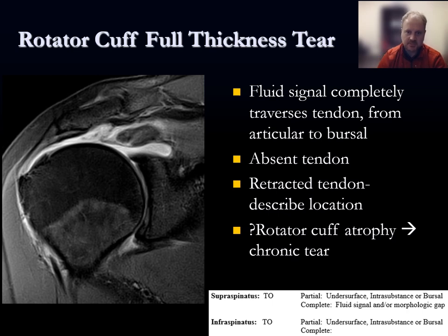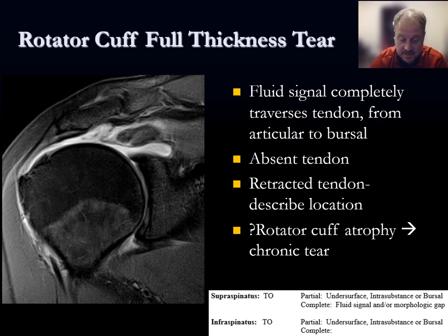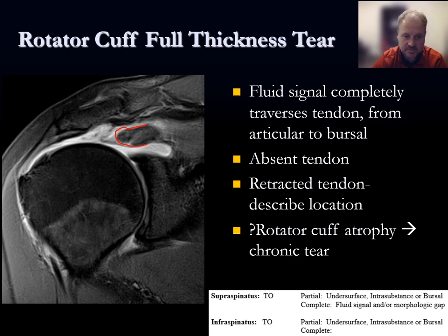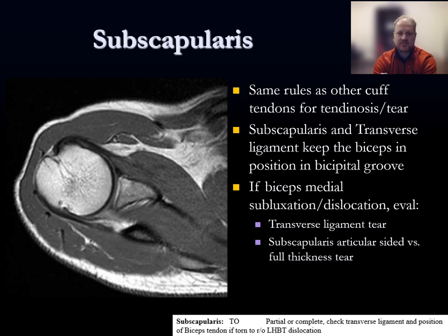A full thickness tear is where fluid signal completely traverses the tendon from articular to bursal side. Additional descriptors include whether the tendon is absent or retracted, and if retracted, where exactly the tendon stump is located. On chronic tears, note any muscle atrophy. On coronal images — especially when there's substantial joint fluid or bursal fluid — you can find and localize the retracted tendon stump, which is satisfying to identify precisely. The subscapularis has the same rules for tendinosis and tear.